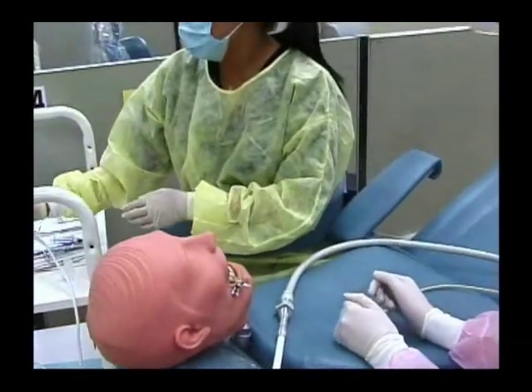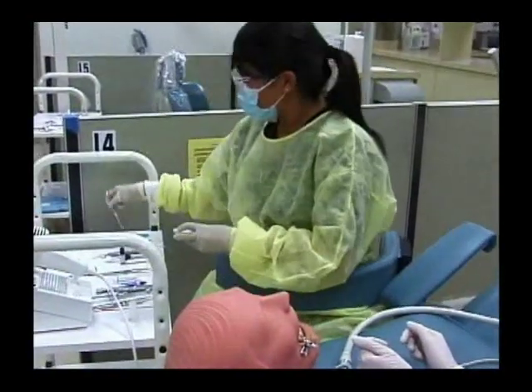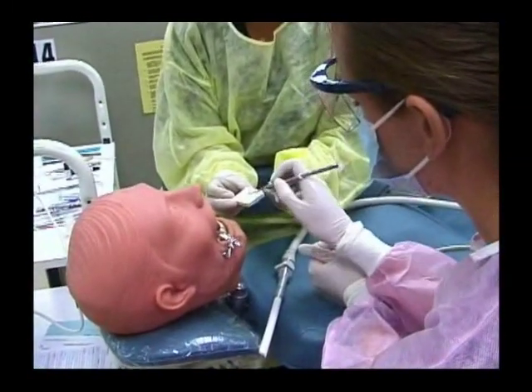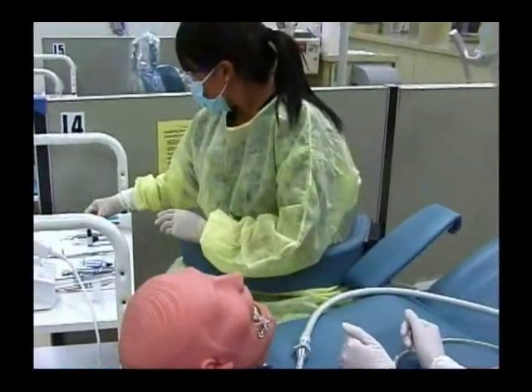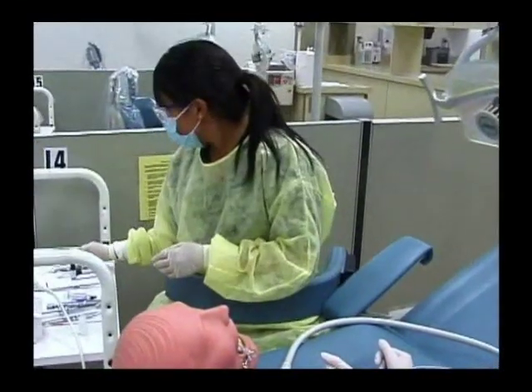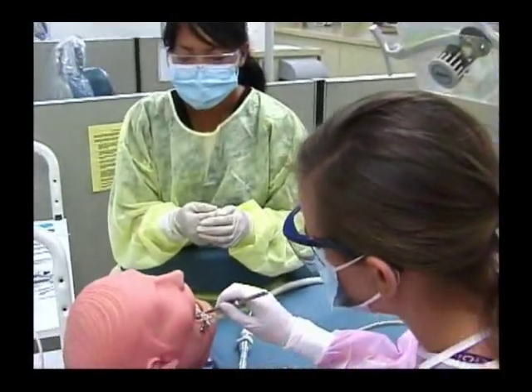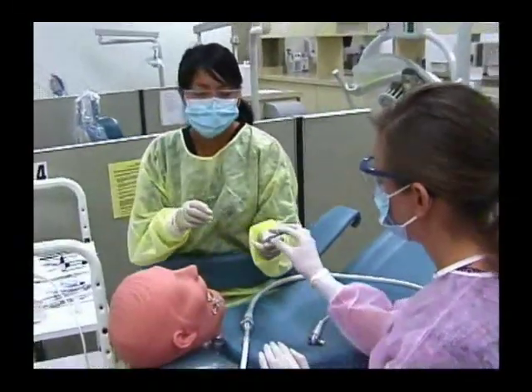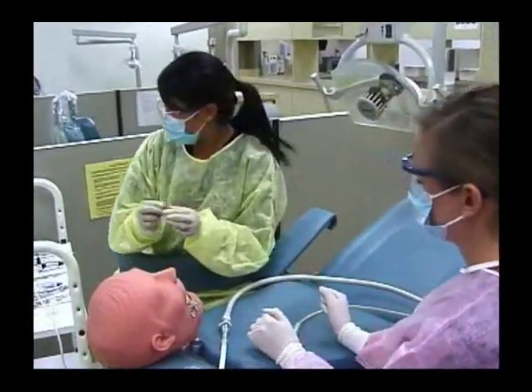Once the material is hardened, the doctor will place the composite material on the tooth. Once the material is placed, the doctor will use instruments such as an interproximal carver to carve the restoration. She may also use polishing burrs or sandpaper discs to smooth the restoration.